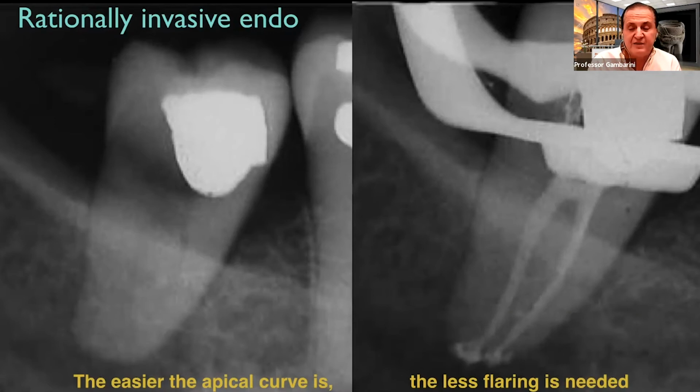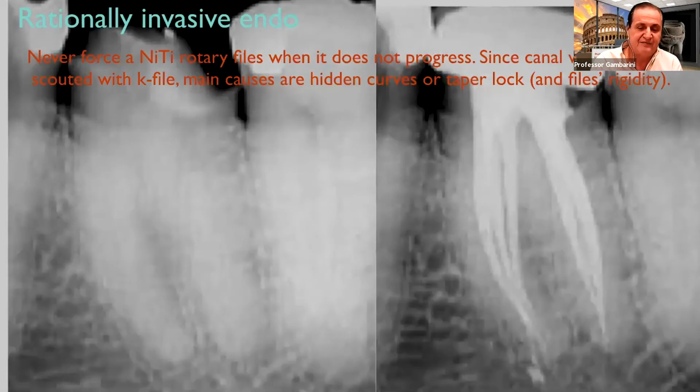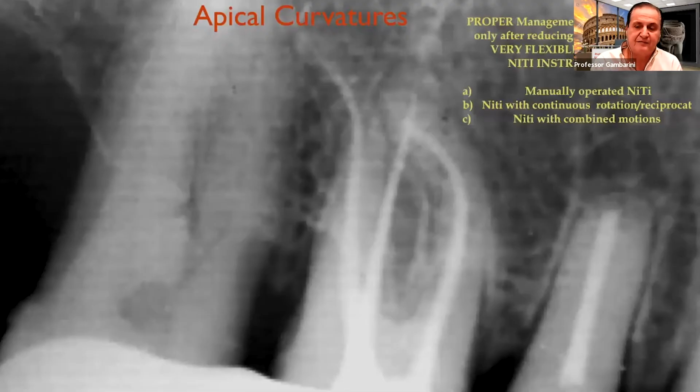And so this shows you a minimally invasive preparation. In this case, I can be minimally invasive because we have a rational approach. Also, in this case, they look complex, but they are not, because we only have to understand where the confluences are located. And since the canals are quite straight, we don't need to enlarge too much. Obviously, what we cannot change are the apical curvatures.